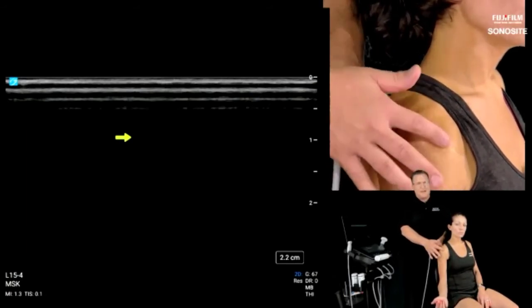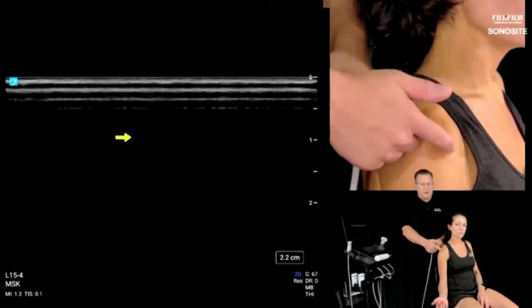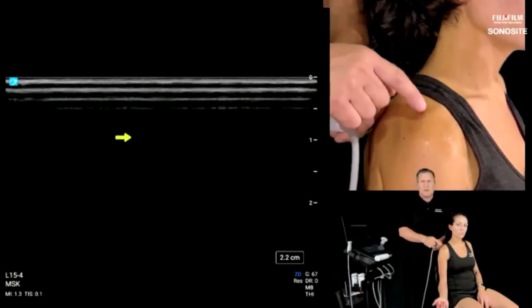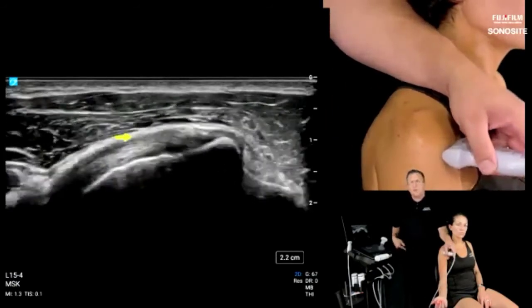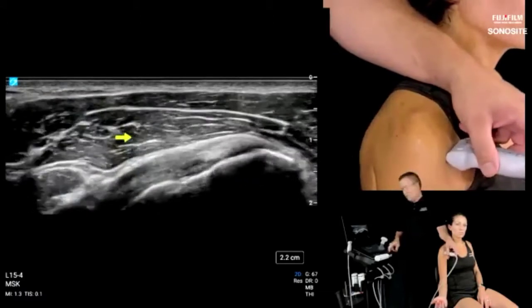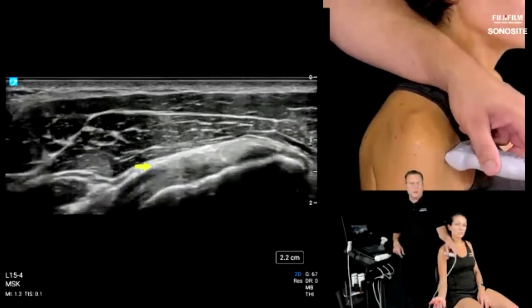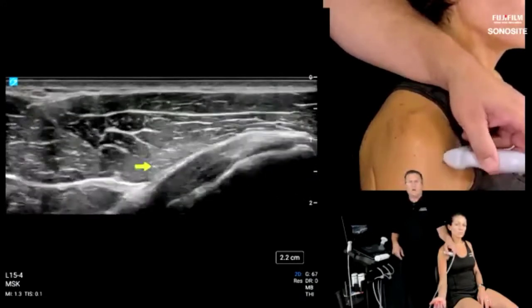But I honestly have never seen a really isolated subscapularis bursa that I could not trace back up to the subacromial in some way, like a little teardrop communication still going up to the main bursa. But it would live just right there on top of the subscap, underneath that subdeltoid fascia, just like we look laterally. It would live here if we could see it, but that's another one of those bursa that is not going to be seen unless there's something wrong. Right. Great question.